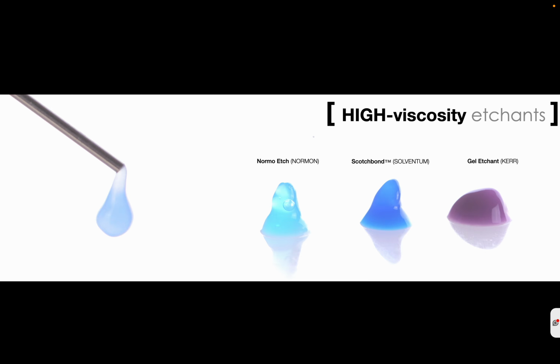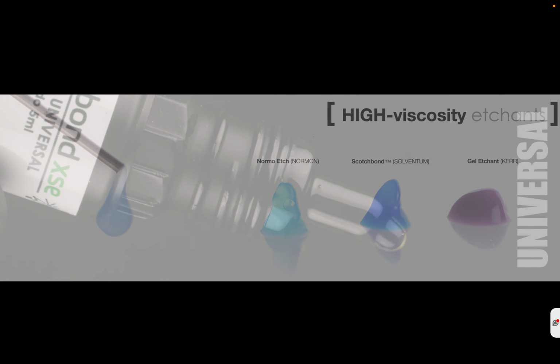For that, it's important that you have a good acid that stays in place. So you need high viscosity etchants.